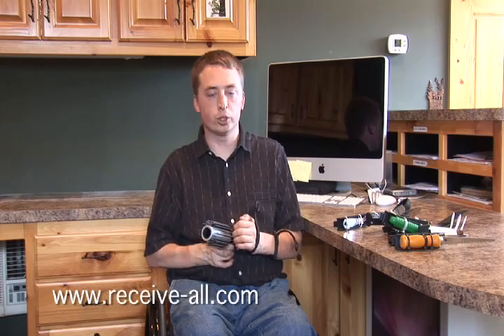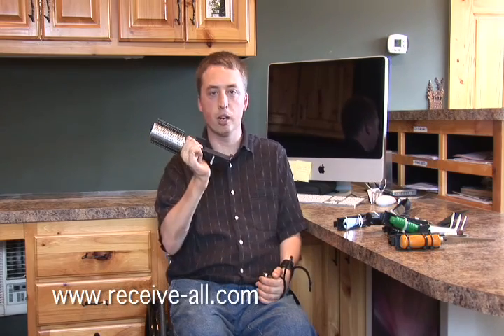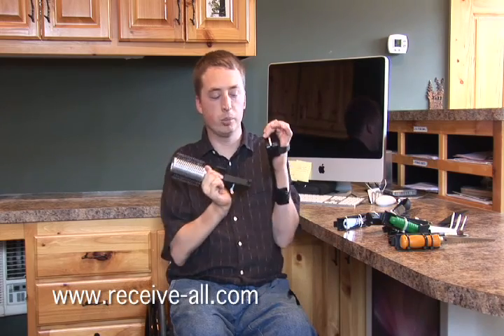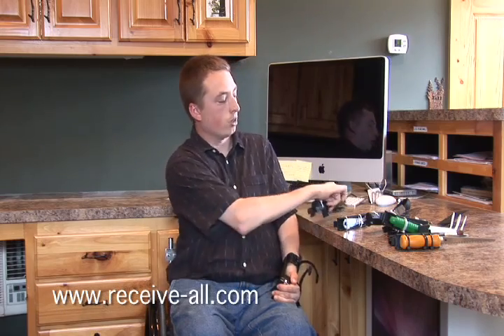The Receive-All has a variety of uses. These items I'm about to show you here are not items that I personally use, but they're items that we have seen that people can use, everyday items that people can use just in their daily living. First being a hairbrush. There's people that have trouble holding their own hairbrush, so this can be attached to the arm brace and an adapter, and then they can use that on their own.